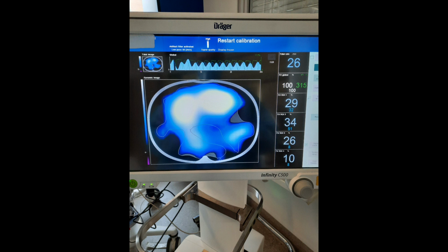Recruitment is pressure over time, and in conventional modes we have access to pressure. We have the inspiratory pressure as well as expiratory pressure to help recruit the lung. But we're very limited in time, because often the patients don't really tolerate a 2-second inspiratory time on conventional modes. So we're often limited to 0.6, 1 second.